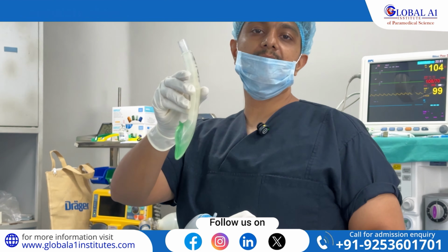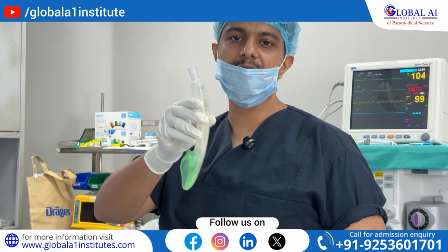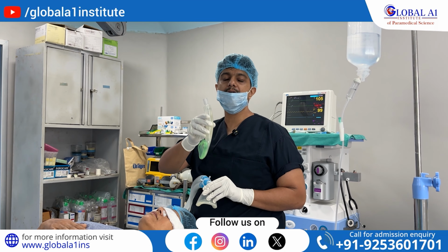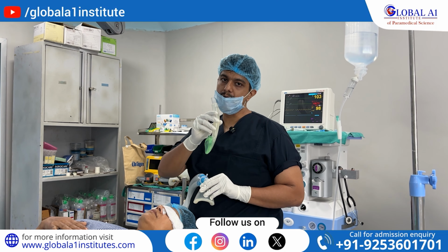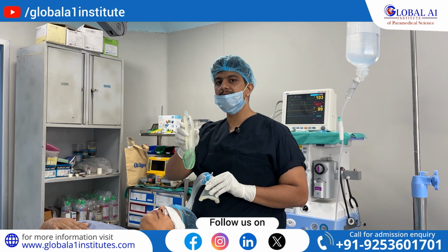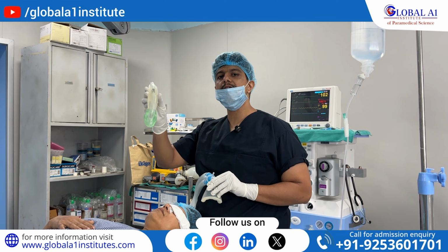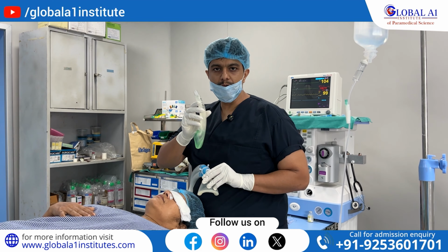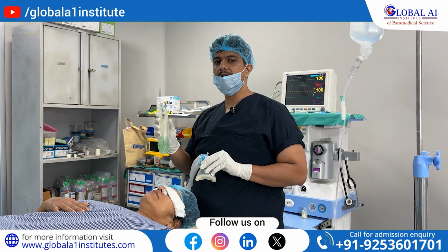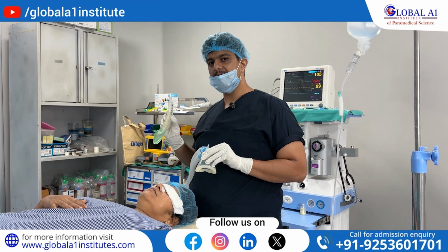As you can see, it was introduced so that we can maintain the airway. Even a roadside person or a paramedic can do this. It comes in all sizes, starting from 1, 1.5, 2, 2.5, 3, 4 and 5. The sizes are meant for the weight. It is used according to the weight of the individual. So it is an SGD, called iGel, right?